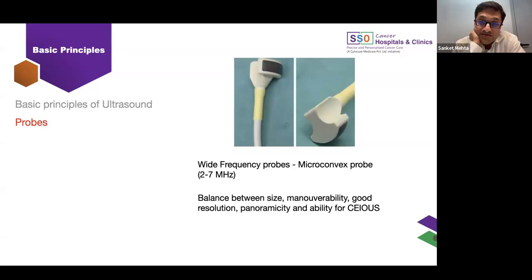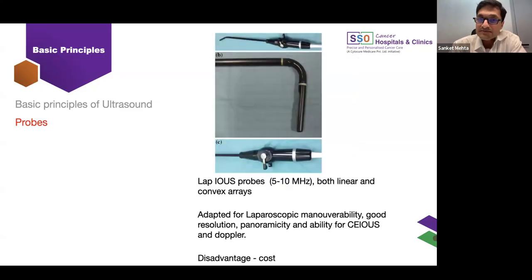It covers a very large field, and it is a perfect balance for liver sonography because it is a convex probe, so you can just tilt the probe a little bit and cover a much greater area and see relations of the various structures and the tumor nodules without moving the probe too much on the surface. It has this finger grip, which helps the surgeon to manipulate very easily with one hand and just two fingers. And it is the workhorse for ultrasound guided surgery.